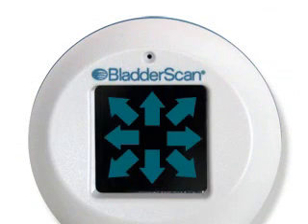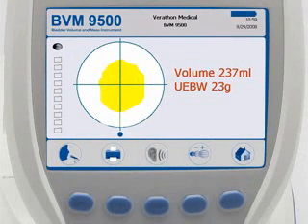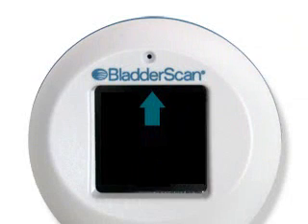The scan is on target when 8 arrows flash on the probe screen and the bladder image is centered in the crosshairs of the aiming display on the console screen. If the scan is off target, the probe will show an arrow indicating the direction to move the probe to be on target.